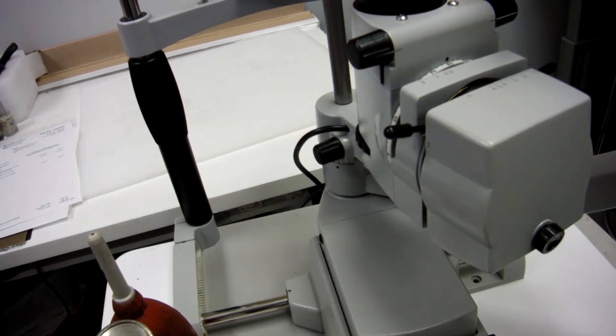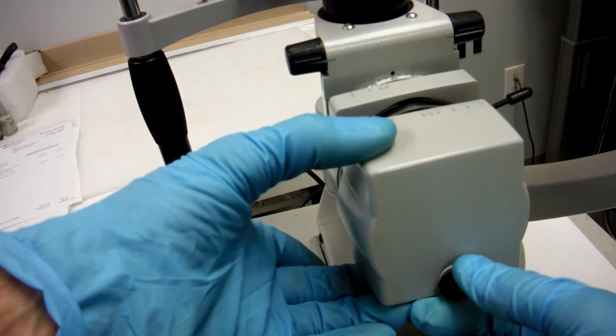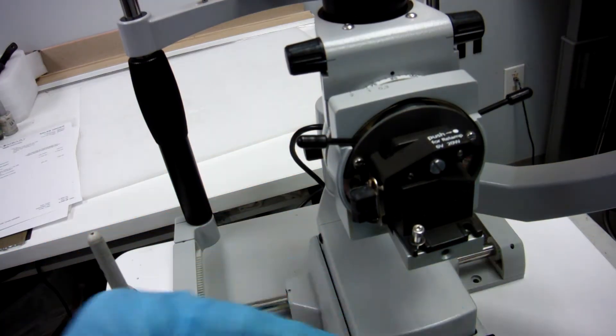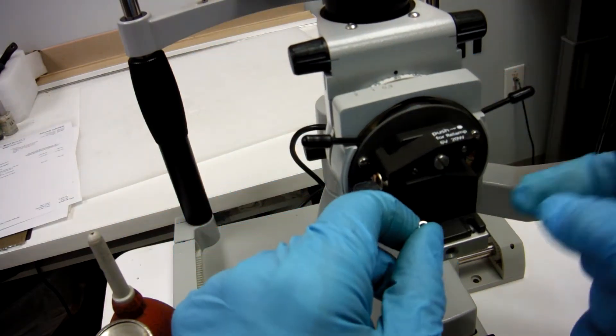When it's time to clean the diaphragm of your Zeiss SL-120, take off your cover, take off the two Allen screws here off of your light assembly.